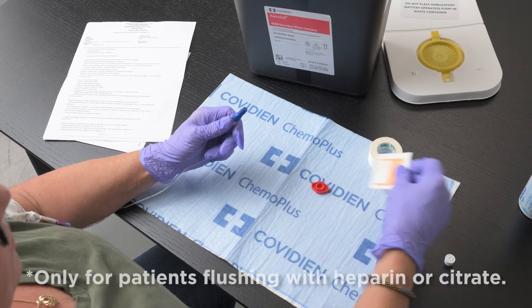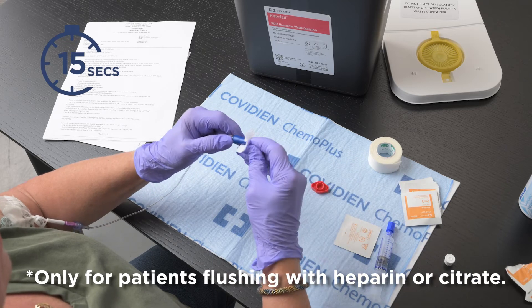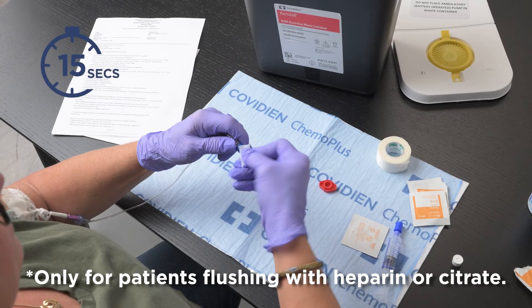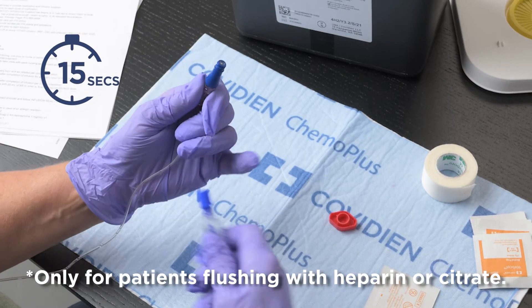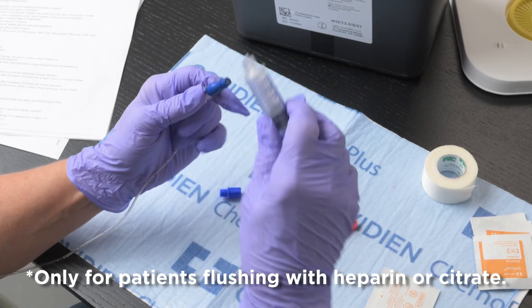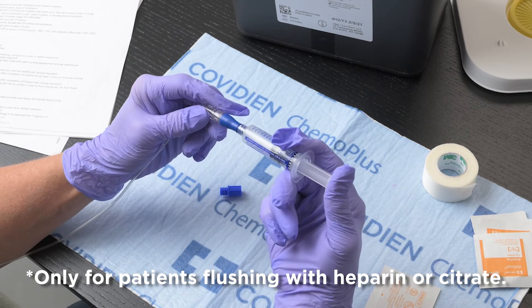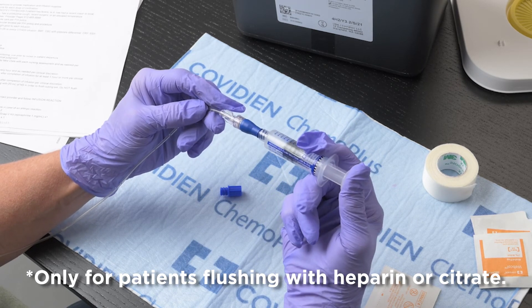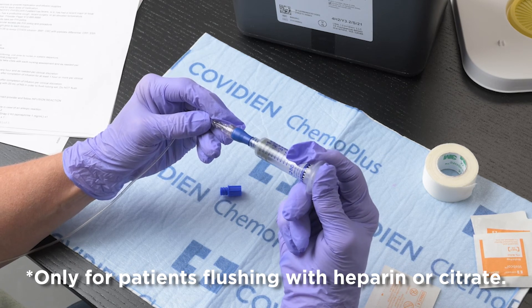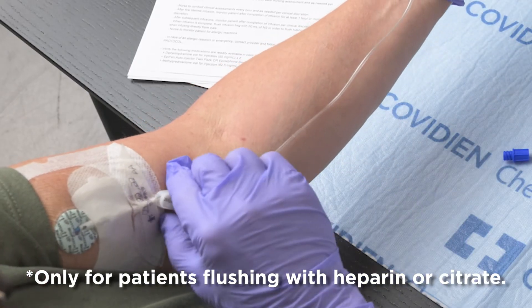Some patients only need to flush with saline. If you have orders to flush with heparin or citrate, scrub the blue end cap again with an alcohol pad for a full 15 seconds and allow to dry. Remove the protective cap from the syringe and remove any air. Twist the pre-filled syringe to the blue end cap and flush. Close the clamp on your line.